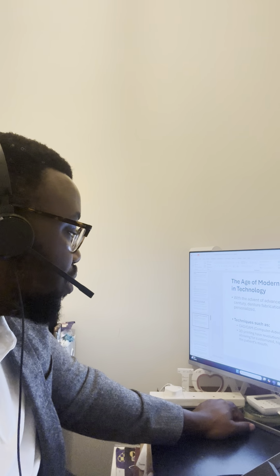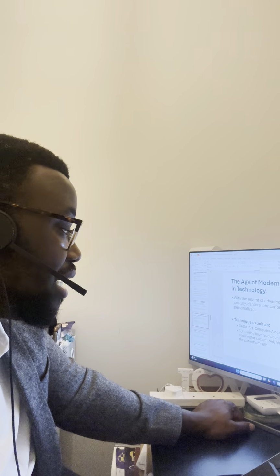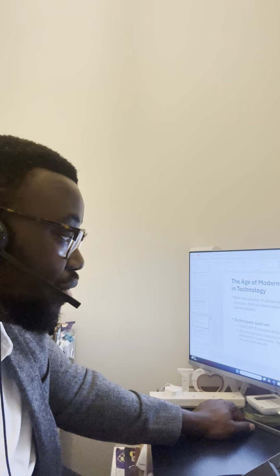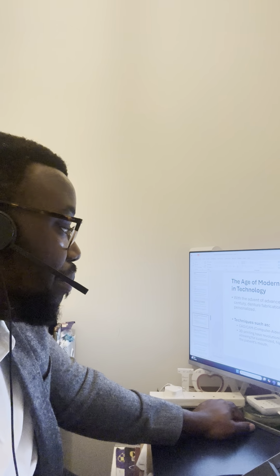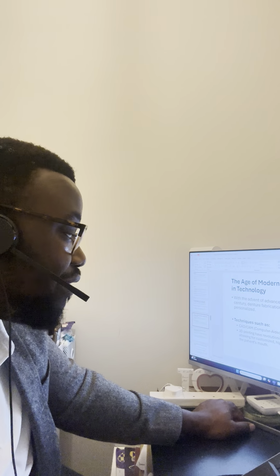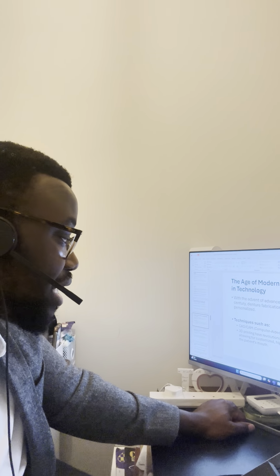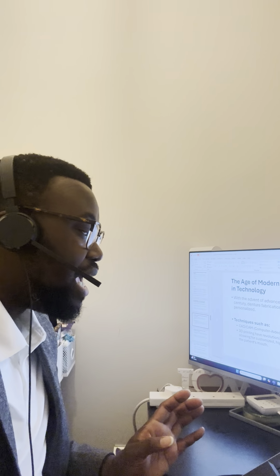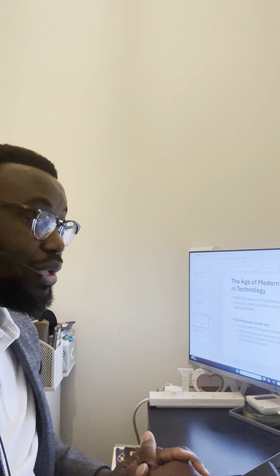So we're now talking about more advanced techniques, such as computer-aided design and computer-aided manufacturing systems and 3D printing machines, which have revolutionized denture manufacturing processes to another level, allowing for customized, highly accurate dentures that fit seamlessly into the patient's mouth.